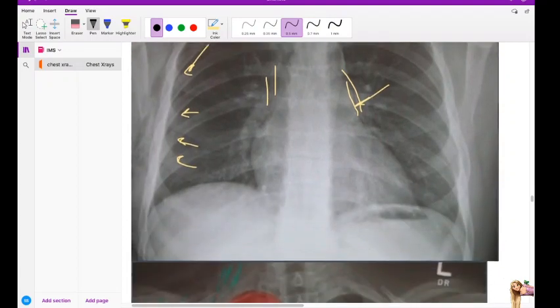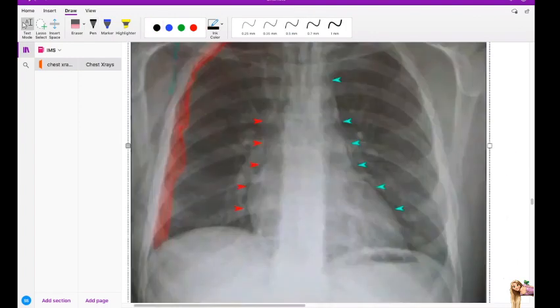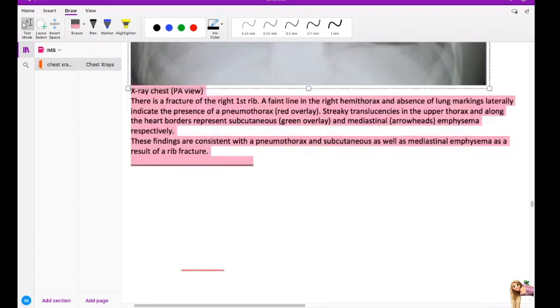Yeah, it's okay. Okay, we're kind of going too long. I don't know what to do. What is this? Yeah, this is the thing which is up.